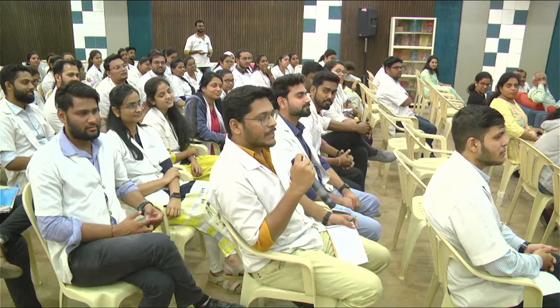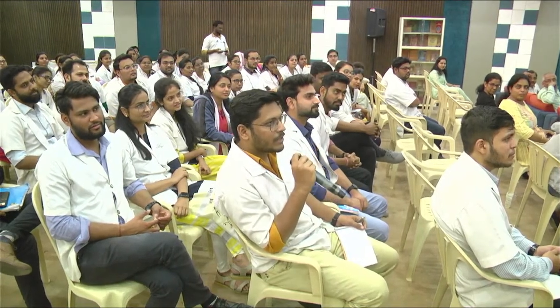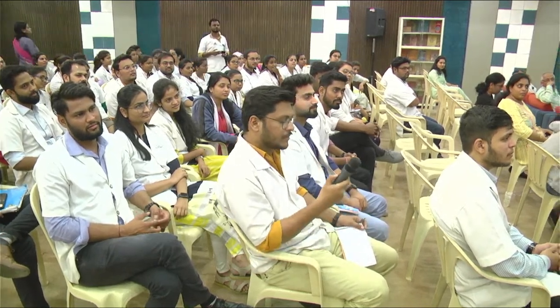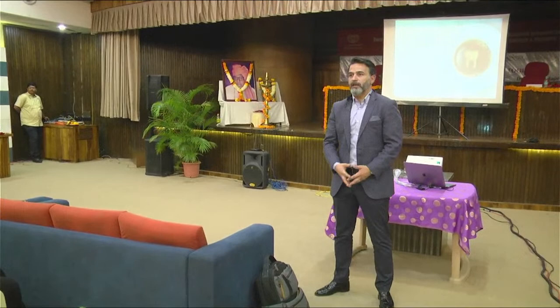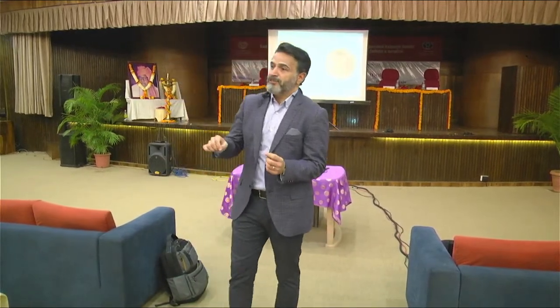Nice to meet you. Sir, my question was, is there any change needed for zygomatic implants or one-piece implants if you are placing them, or is the procedure the same? Okay, and it's an advanced surgery. The zygomatic implants are good things. When you don't have anything to do in the maxilla, you place zygomatic implants, but it's not the M-Guide procedure's issue.